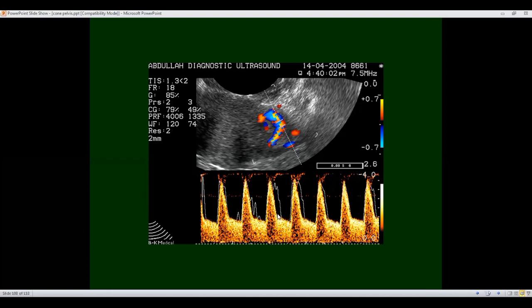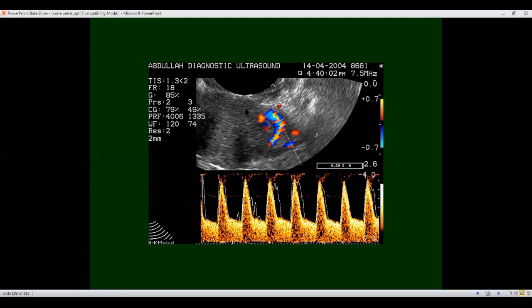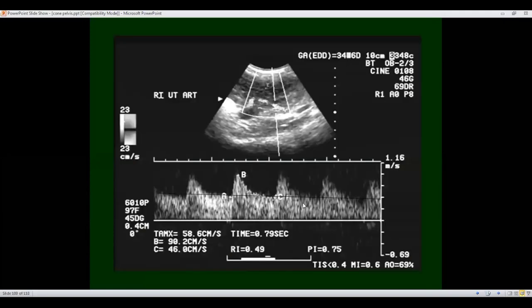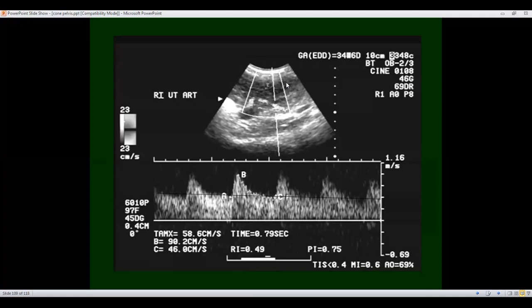Here you can see that the diastolic notch is absent - it is filled with blood - because the growing fetus demand, the placental demand, and the fetomaternal exchange are all increased. We will do this in one of our patients in a moment - she is pregnant and we'll see how we will find the filled diastolic notch. And later on more and more diastolic flow will be seen as forward diastolic flow as the fetus grows in the late second trimester and also in the third trimester.